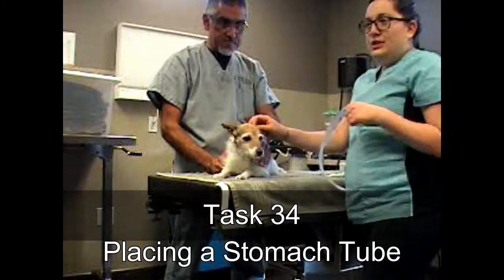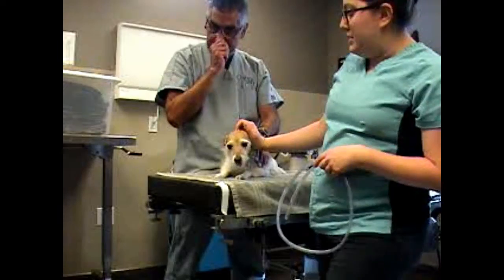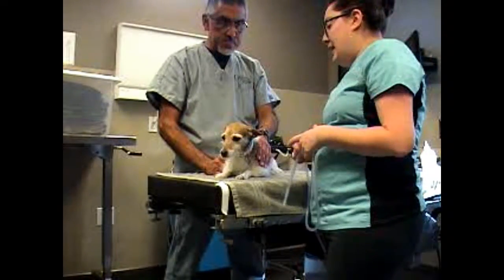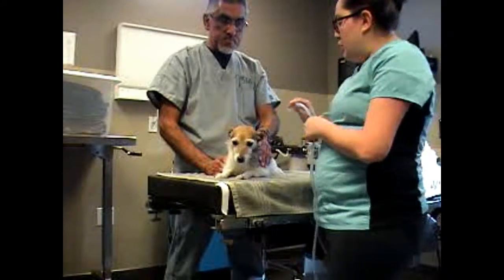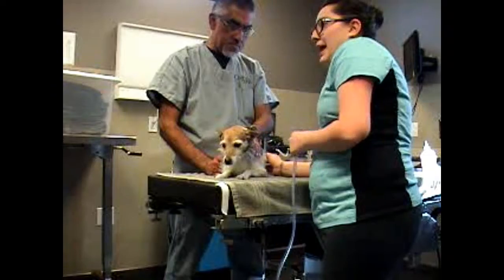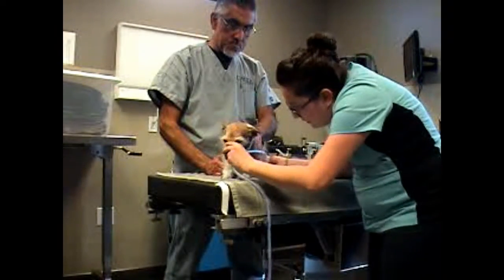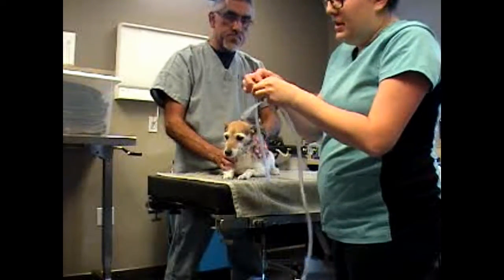Miss Phoebe here, just to show you how we would place a stomach tube in this dog. She doesn't need one today, but if we were to need to place a stomach tube for her, we would want to measure the stomach tube all the way to her last rib, so last rib's there, to her canine tooth, and just mark that on the actual stomach tube.